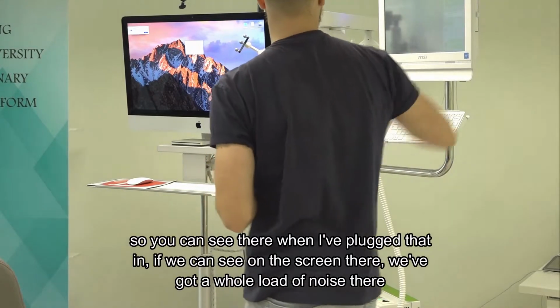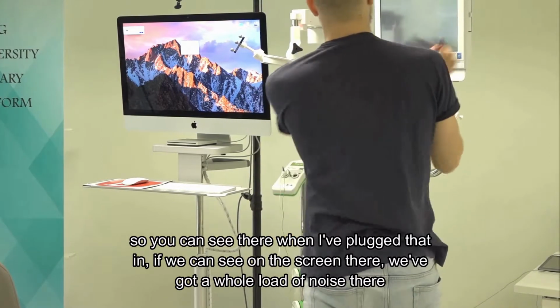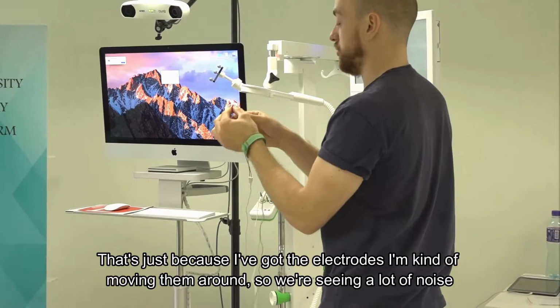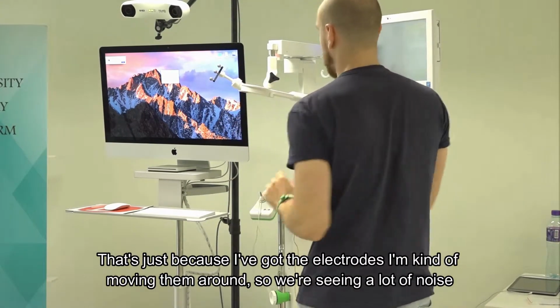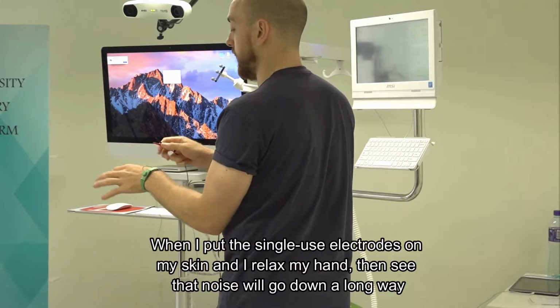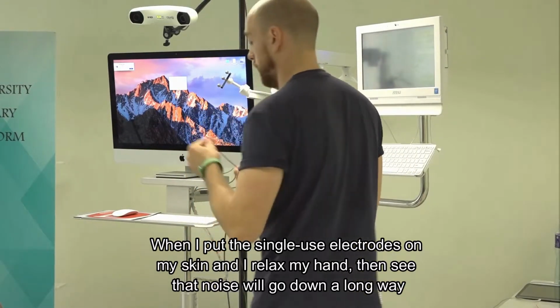You can see when I've plugged that in, if we look at the screen, I'll double tap, we've got a whole load of noise. That's just because I'm moving the electrodes around. So we're seeing a lot of noise. When I put the single-use electrodes on my skin and I relax my hand, we'll then see that noise go down a long way.